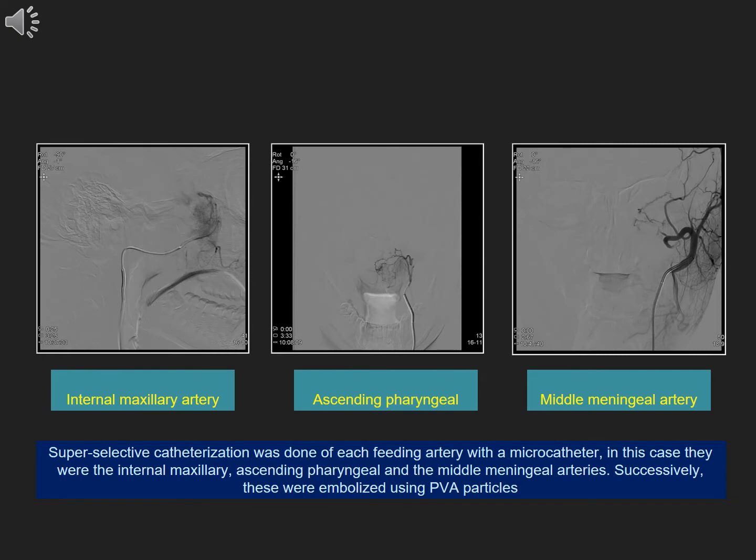Superselective catheterization was done of each feeding artery with a microcatheter. In this case, they were the internal maxillary, ascending pharyngeal, and the middle meningeal arteries. Successively, these were embolized using PVA particles.